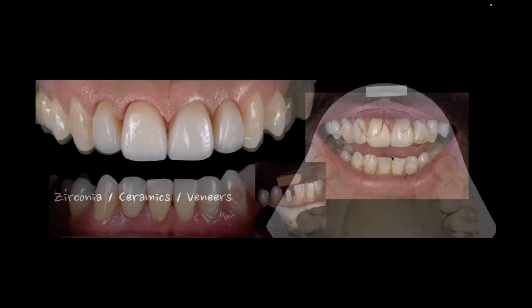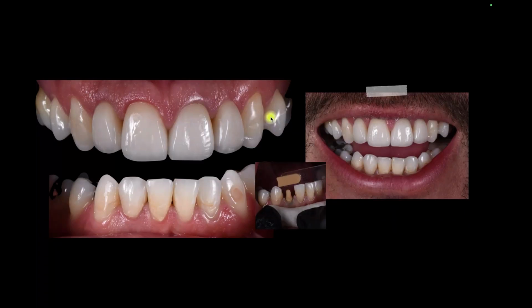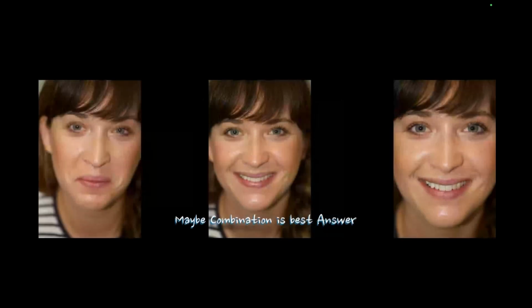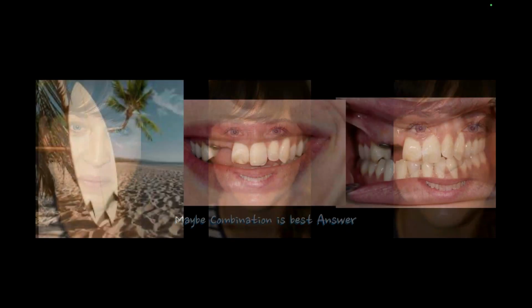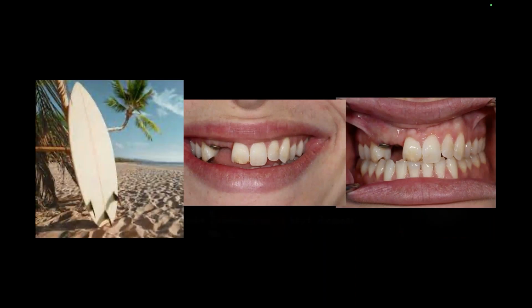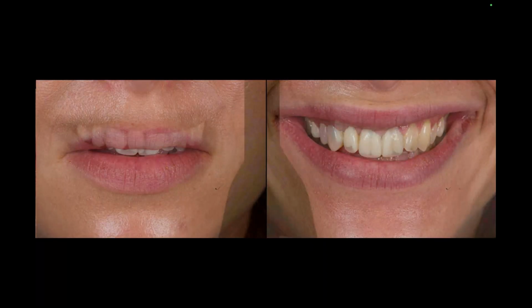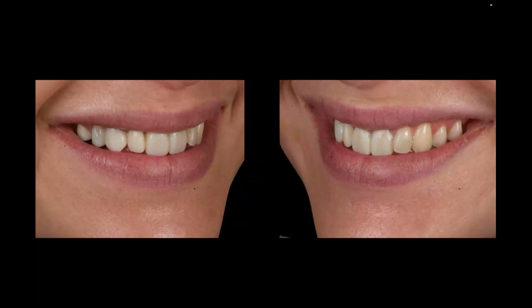So you'll notice that this is layered zirconia, and these are feldspathic veneers next to the layered zirconia, right? So did I mask perfectly? No, value is definitely a little down over here, but at least I got it somewhat in the ballpark. And when I come out in a monolithic world, you can kind of see it fits into the face. Also with zirconia, when I have those challenging spaces, a lot of times, or implants where there's more space, again, I'm going to go back to those opacious materials, or maybe I'll just use fluorescence instead, right?